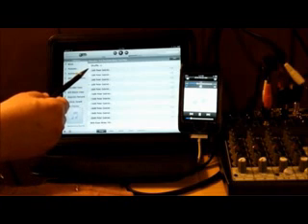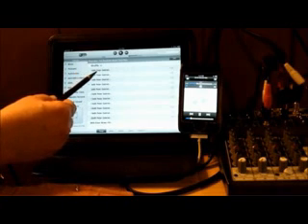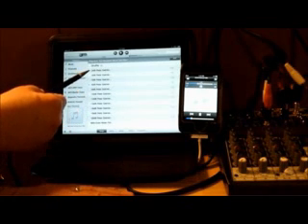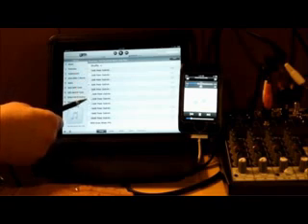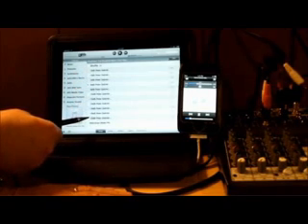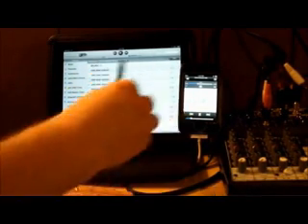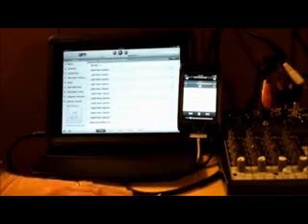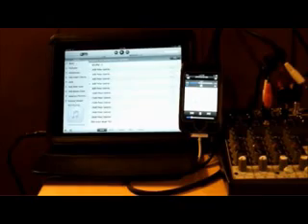It has about a 1-minute selection of a Peter Gabriel song that's been recorded at various levels. We start with a maximum level we'll call 0 dB, and then in 2 dB steps all the way on down to minus 20 dB. These two signals are combined in this small mixer, which in turn drives the receiver under test.